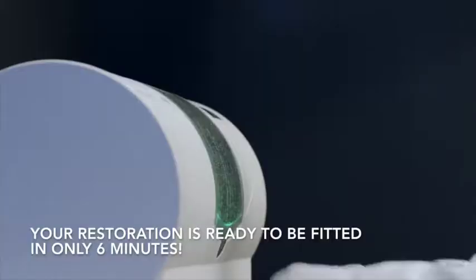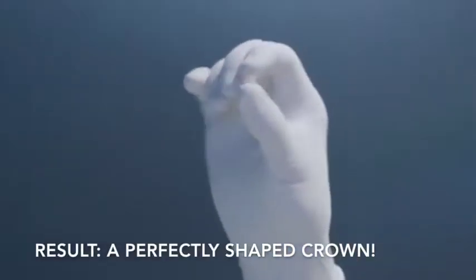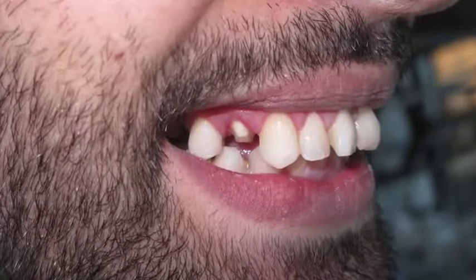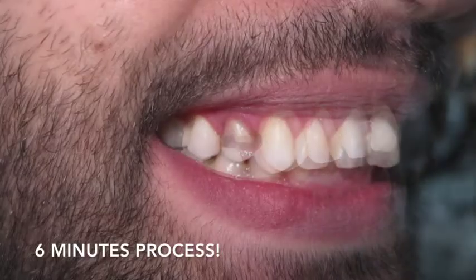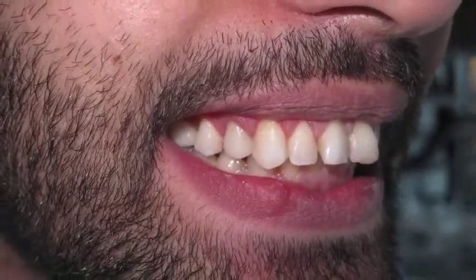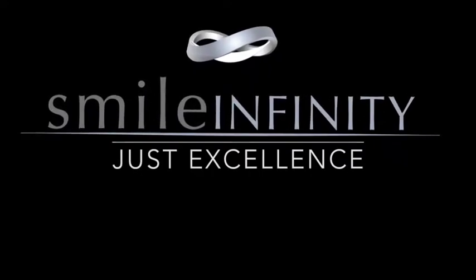Your restoration is ready to be fitted in only six minutes. Smile Infinity — just excellence.